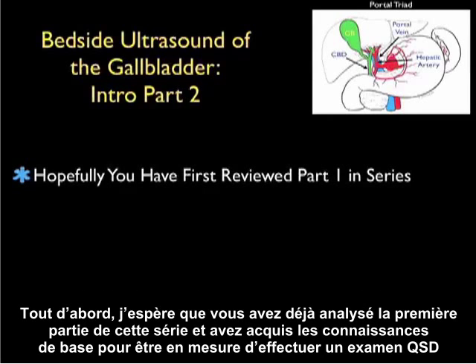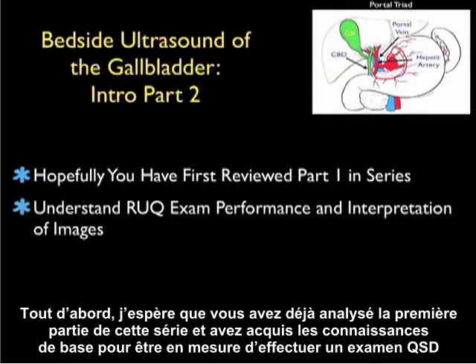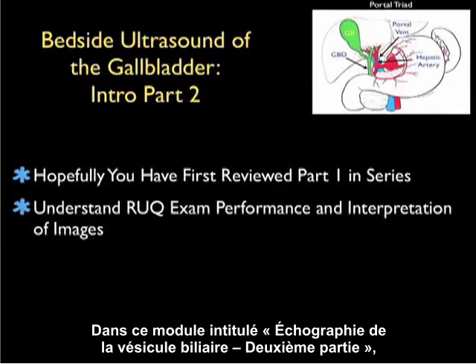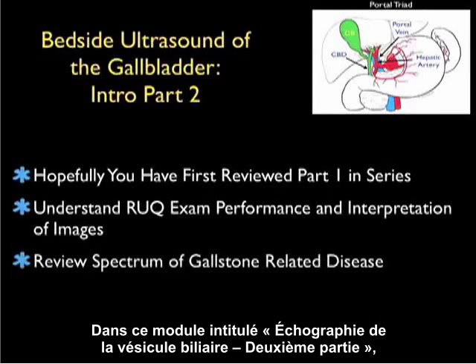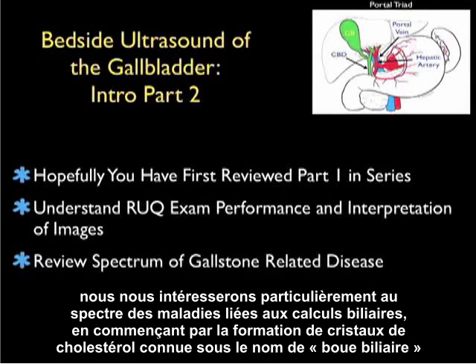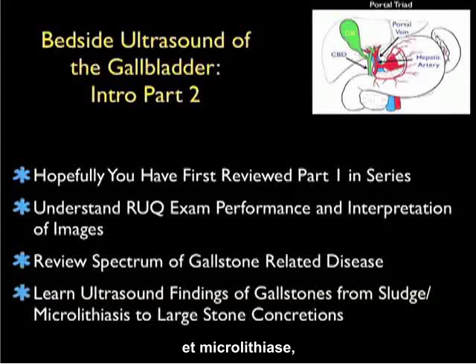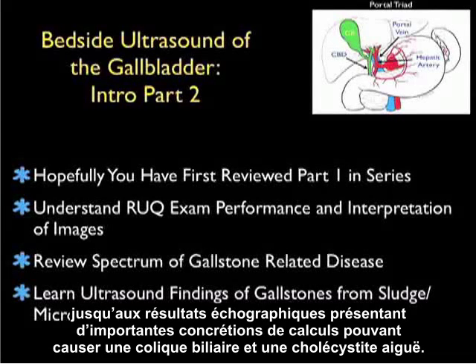Hopefully you've reviewed Part 1 in the series and have a basic understanding of how to perform the right upper quadrant exam and how to interpret the images you will obtain. In this module, Part 2 of Gallbladder Sonography, we're going to focus specifically on the spectrum of gallstone-related disease, beginning with the deposition of cholesterol crystals known as gallbladder sludge and microlithiasis, on to the ultrasound findings with large stone concretions that may cause biliary colic and acute cholecystitis.